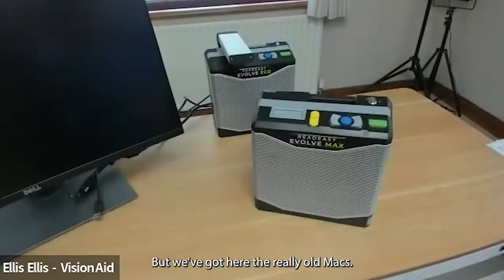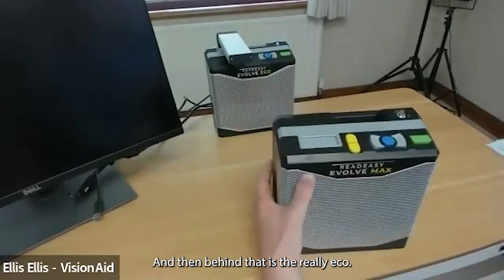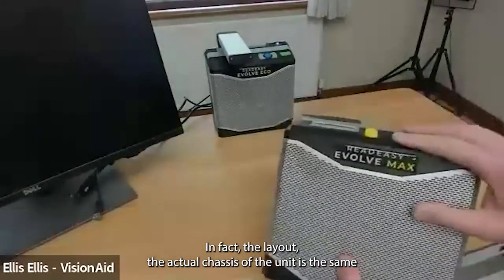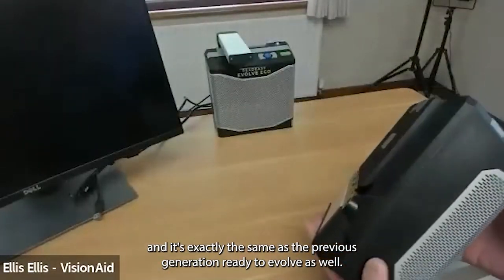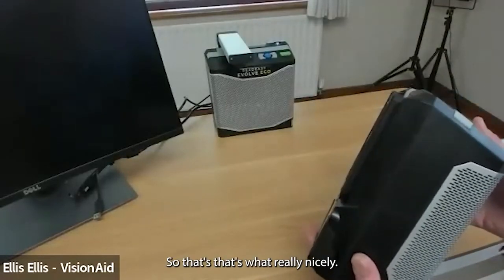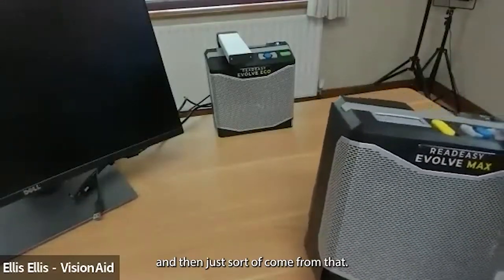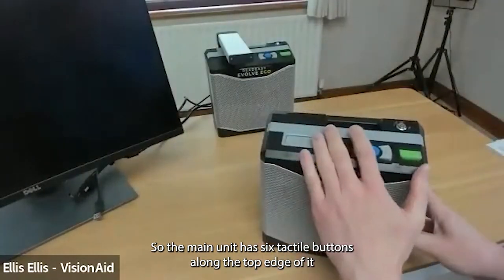We've got here the Read Easy Evolve Max, and behind that is the Evolve Eco. I'm going to show the form factor because they're pretty much identical — in fact the button layouts and the actual chassis of the unit are the same. It's exactly the same as the previous generation Read Easy Evolve as well, so we've kept that form factor and changed some of the software. On the Eco the hardware is different.